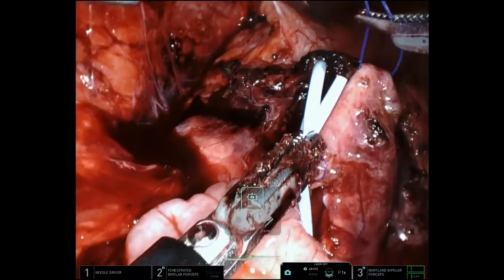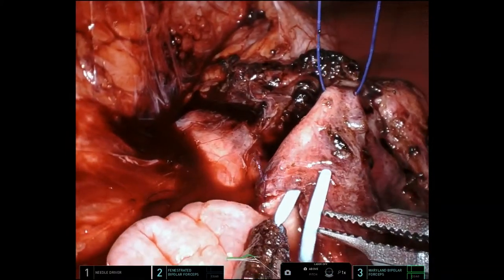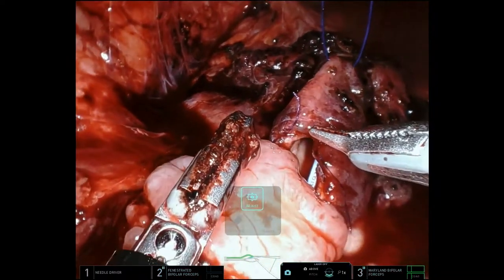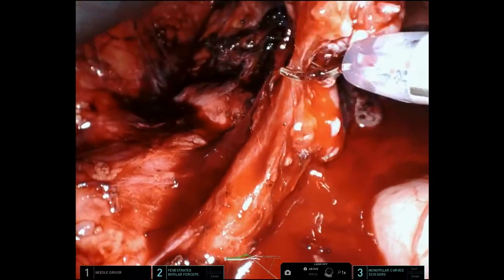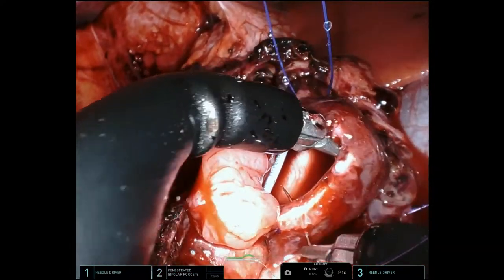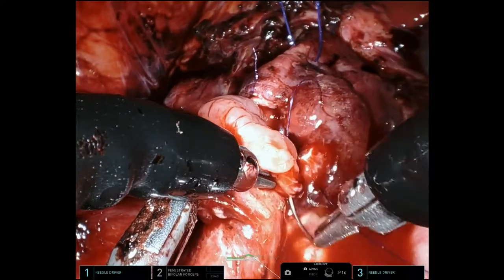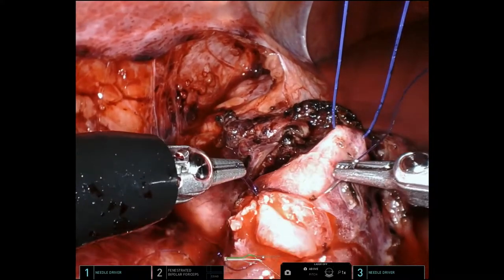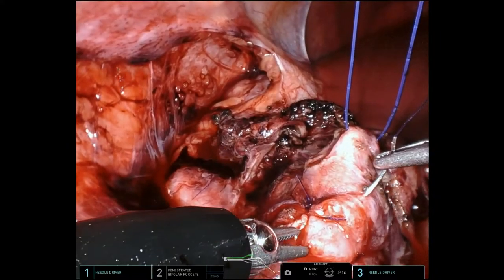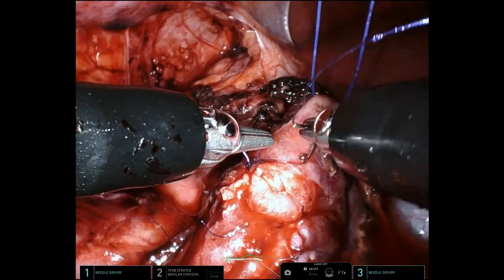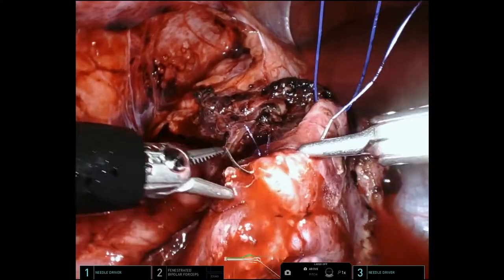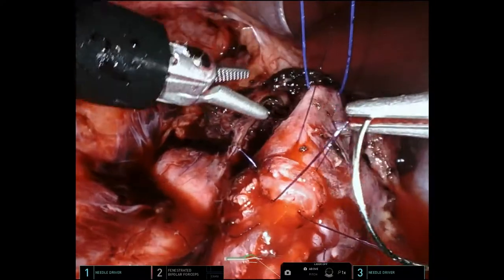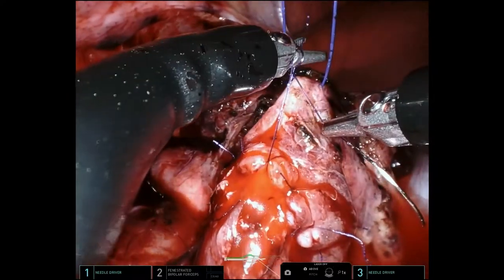This is redirecting the stent back inside the renal pelvis. Now the excess ureteral tissue that's strictured and diseased can be removed and passed off, and the remainder of the anastomosis can be completed. My strong preference is to complete all of the anastomosis in a pyeloplasty with interrupted sutures. I feel that provides a little bit more stability and insurance to the anastomosis. I worry about running suture lines in that if one suture pops out or rips through tissue, the entire suture line becomes compromised. In this case, multiple sutures all provide their own integrity to the anastomosis.